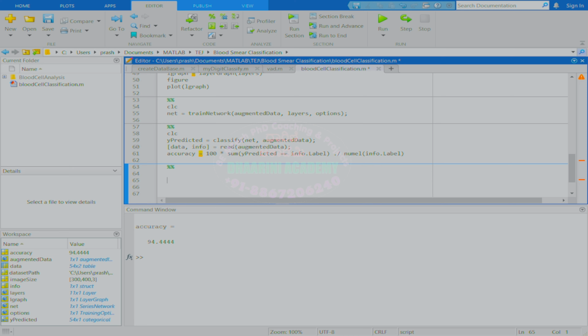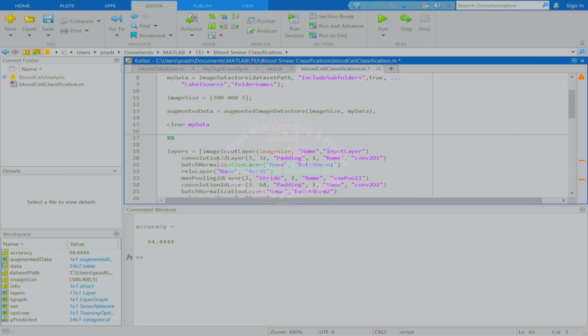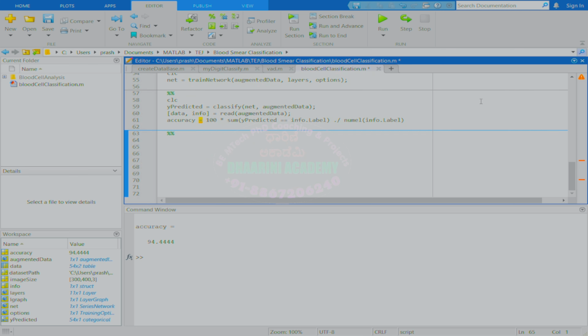Now, let me go to the second layer, and that's a convolutional 2D layer. So the first layer is image input and the second layer, right? So here I want to visualize the weights. Okay, so let me go for the name. Name is equal to, in the trained network, I think I have given the name as net itself. Let me check. Yeah, it's net.